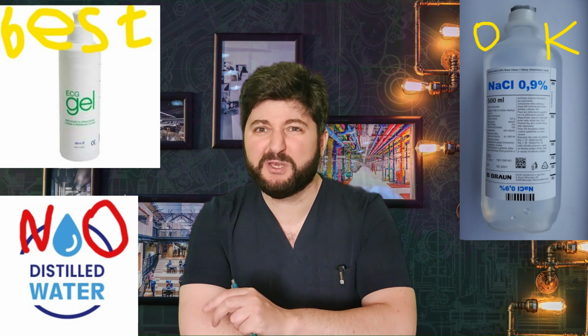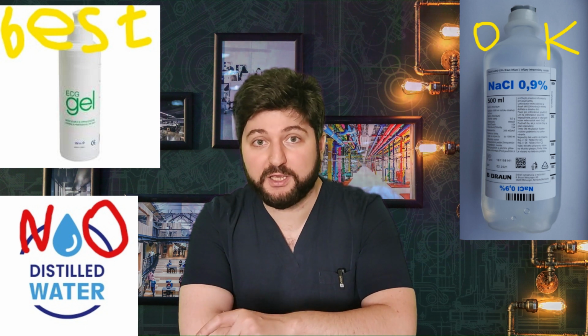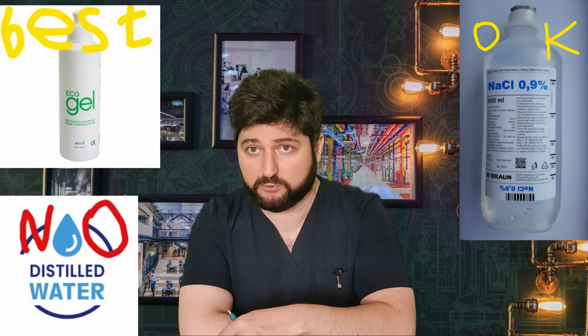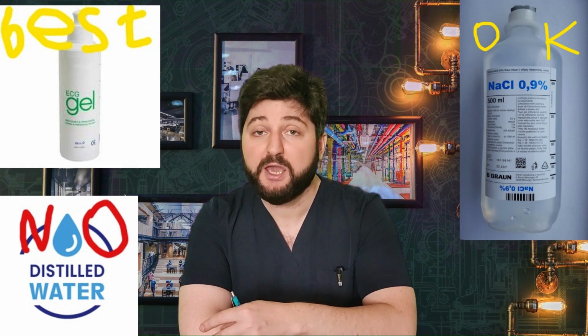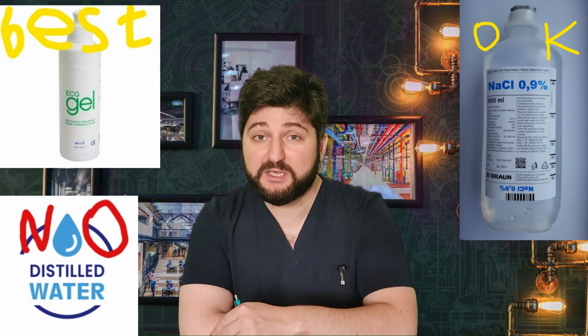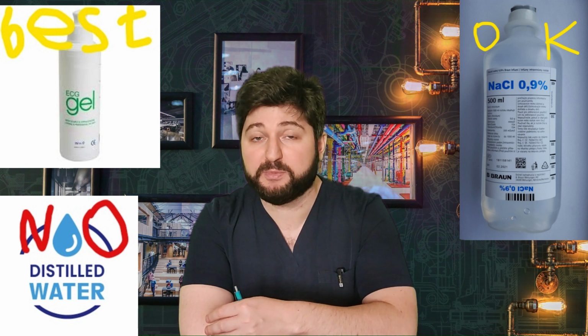Now keep in mind that the vast majority of ECGs are done in hospital, so don't take distilled water without electrolytes, which there is a lot of in the hospital for injections and other purposes, because this water will not be good. It will do the opposite, making the ECG worse rather than better. All the other conductive substances will be great.